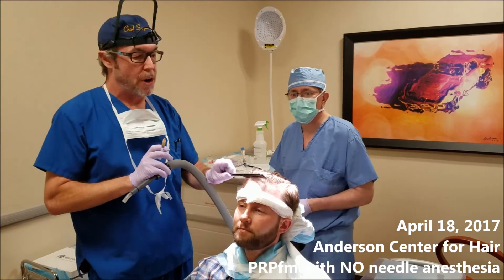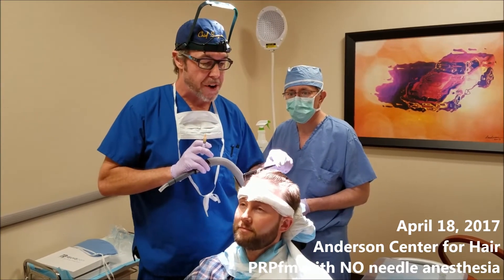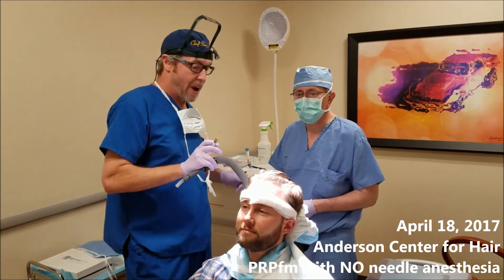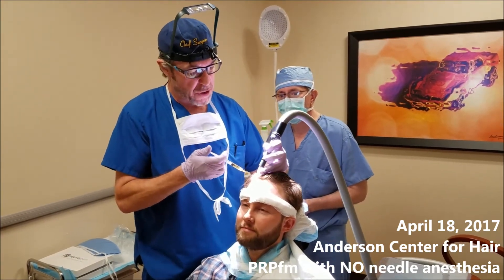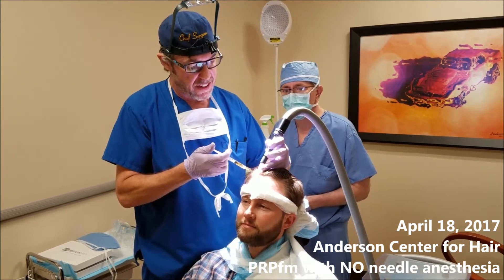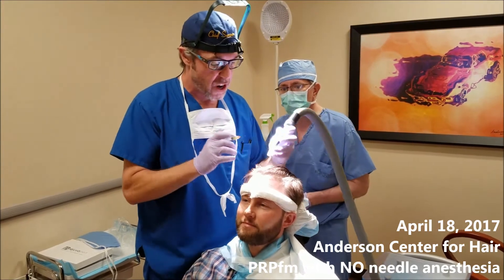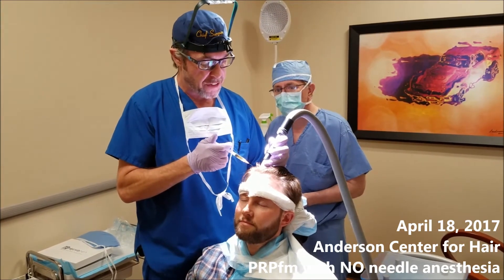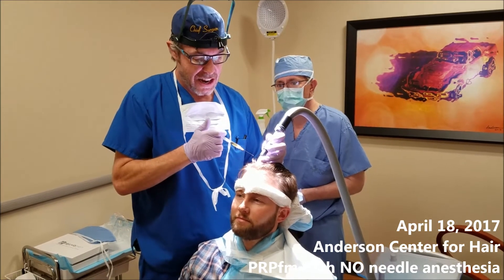For those folks at home who are worried about the PRP — I know a couple of weeks ago I had one done on myself where I had my own head anesthetized and that wasn't very painful at all. This is a much more relaxed way of doing it where we don't have to rely on the needles.